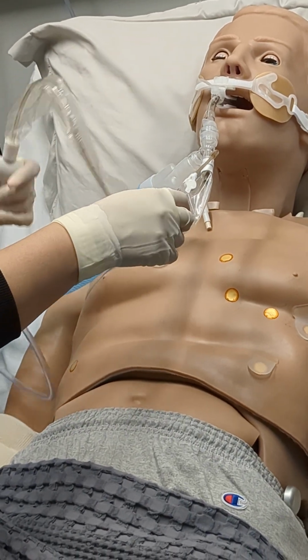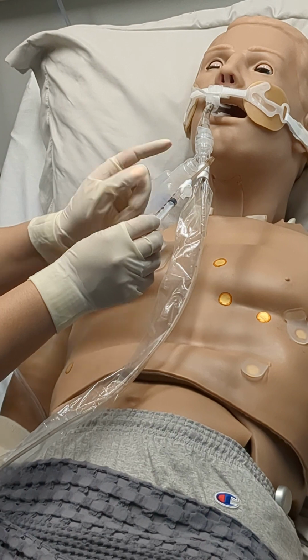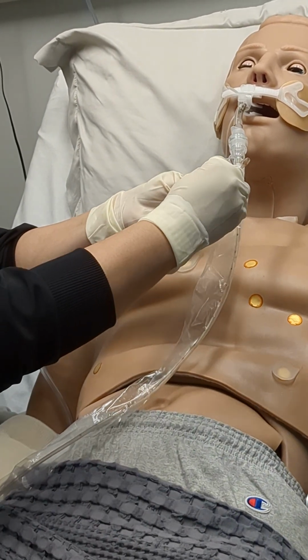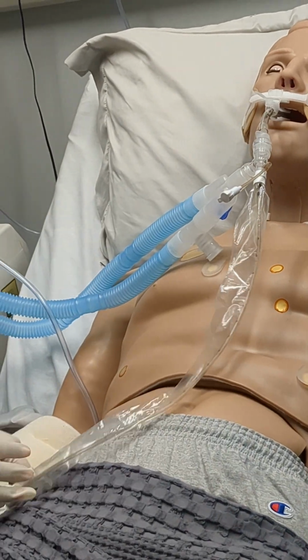Oh, okay. So then what you do is that you're going to pull out the little bit of water that stays here, so that it doesn't stay in your patient. What if you forget to push the button? You're gonna put water directly into their lungs.